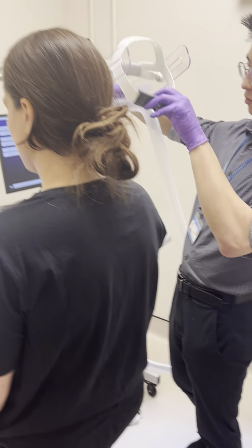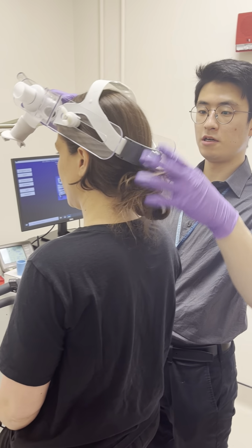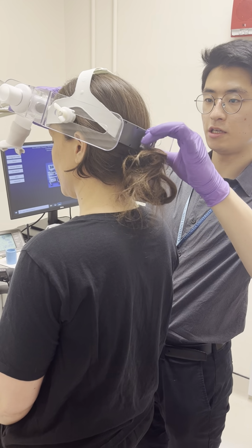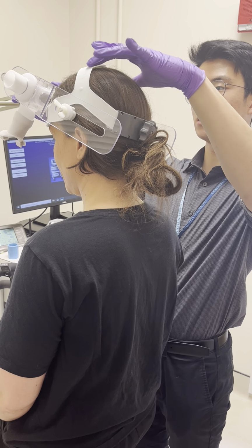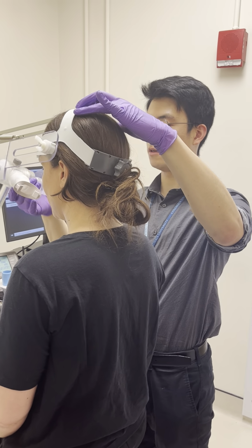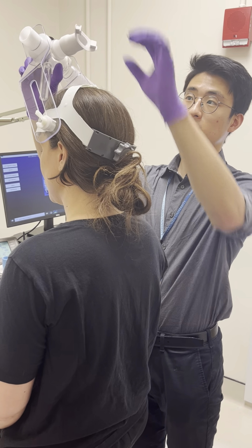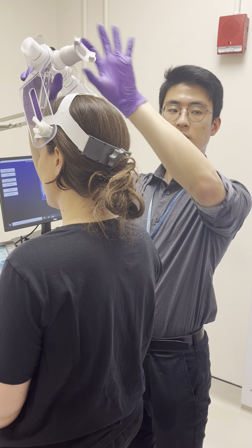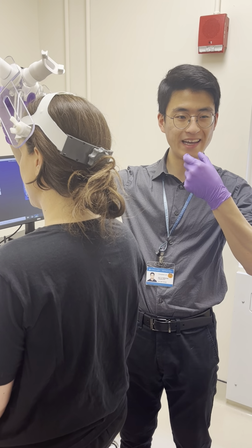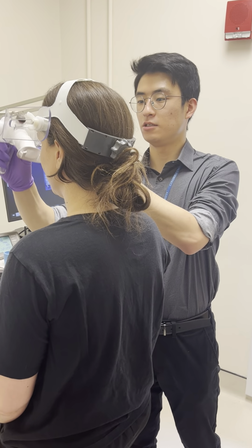Alright. So you want to make sure that this isn't poking them in the face. So headgear goes on. And just tighten. You want to make sure that it's snug, and then that you can adjust this, right? And so the subject is gonna bite down on these two pieces and then close their lips all the way around it. Usually the best way to do it is to get it all the way in first, have them close their lips, and then bite down on the two pieces.